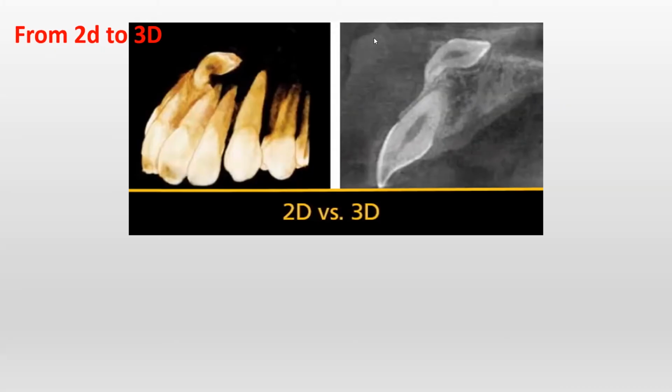3D dental imaging, which is also known as CBCT, cone beam computed tomography, is a more advanced imaging technology used in dentistry. I'm sure all of you are aware this type of imaging has provided a detailed and comprehensive view of teeth, bone, nerves, soft tissue, and surrounding structures in the oral and maxillofacial region.